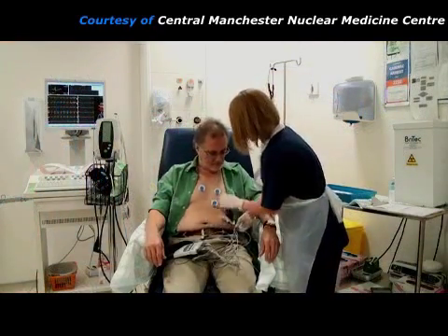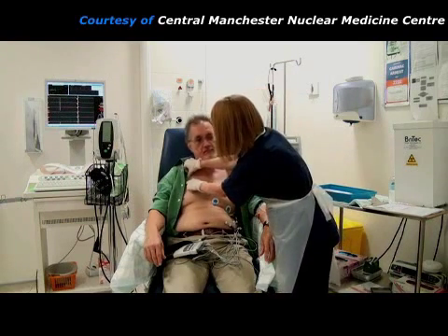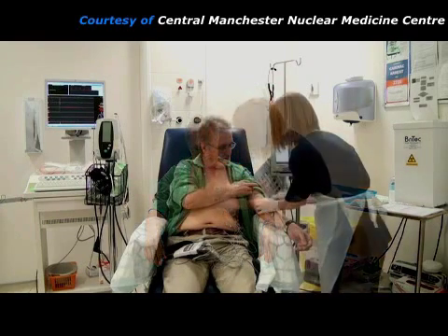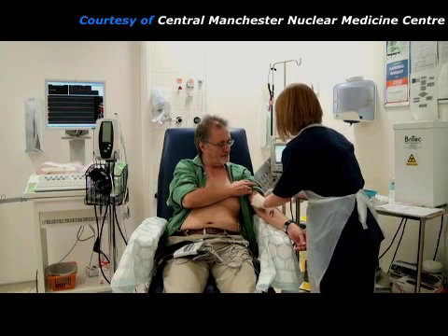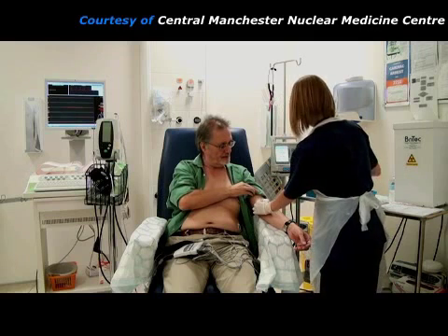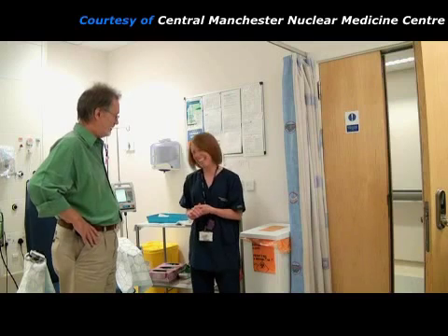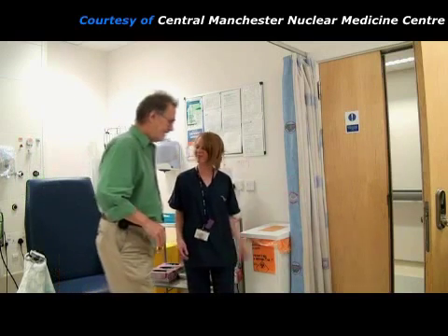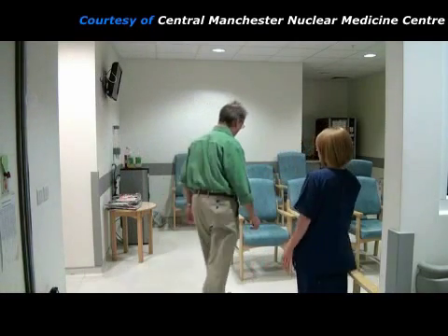The stress injection part of the procedure is now finished. Most of the ECG electrodes are removed, but 3 electrodes are left for use later on. The needle can now be removed from the patient's arm. The practitioner checks that they have fully recovered and are feeling okay. Then the patient goes to a waiting room reserved for radioactive patients, where they will wait for about 1 hour before images of their heart can be taken. During this waiting time, they can have a drink of tea or coffee if they wish.